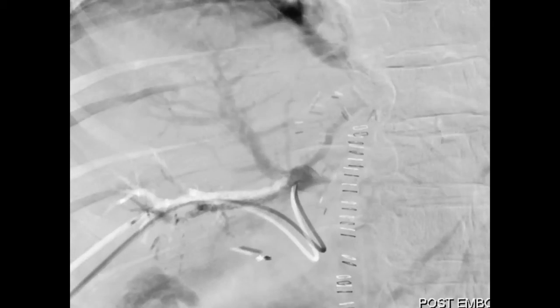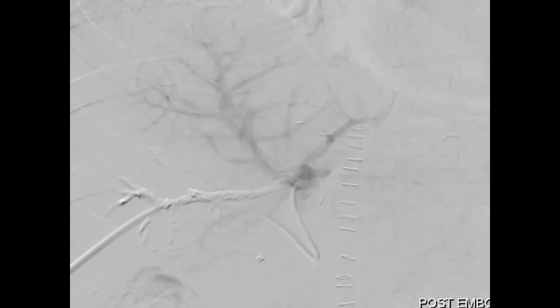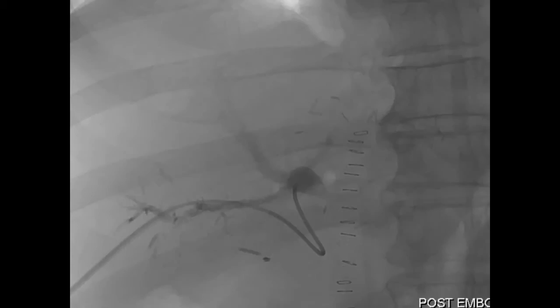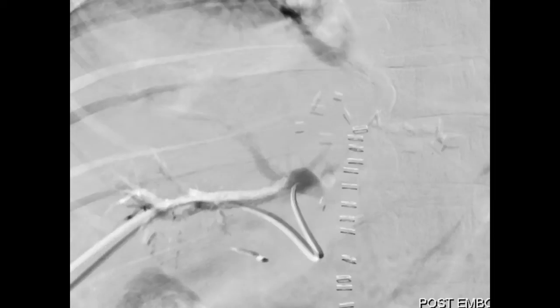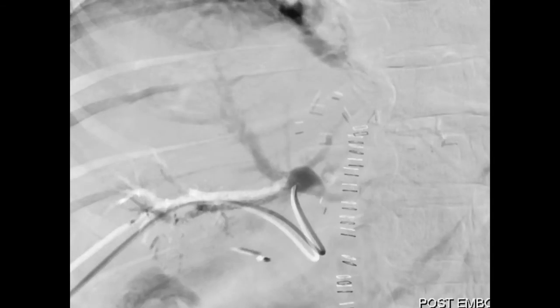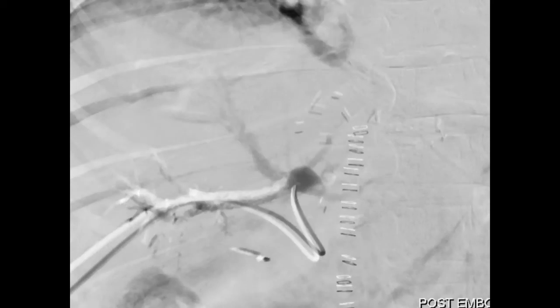When I start embolizing the first branch, I usually inject a very small amount of Glubran and lipiodol, around 0.1 milliliters, to test the mixture and feel how it is going to react in the portal vein, how far it goes. Then I flush with a lot of glucose. It can differ from patient to patient. Here you can see that the first part of embolization is successful as the branch is completely occluded.